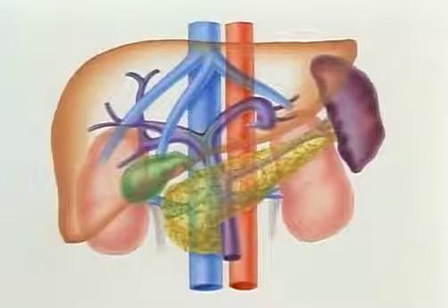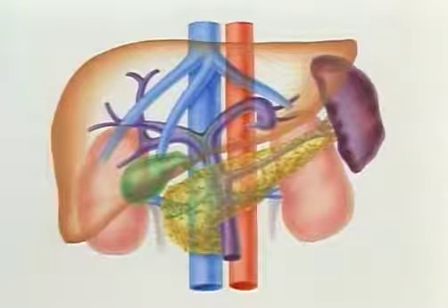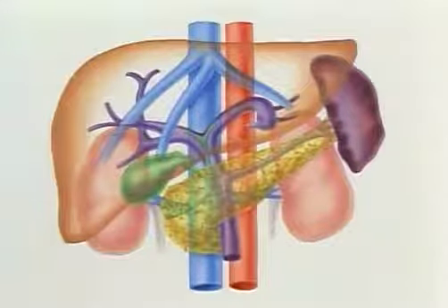Ultrasonography is especially effective in evaluations of the liver, gallbladder, pancreas, kidneys, and spleen. Recently, the digestive tract, such as the stomach and the intestines, has also been successfully visualized. During the examination, we use this probe to view the internal structures of the human body.